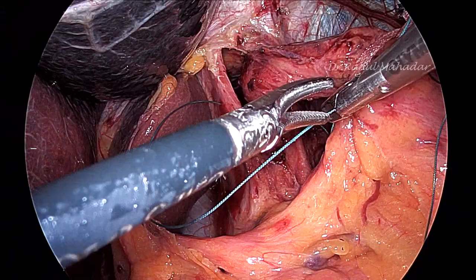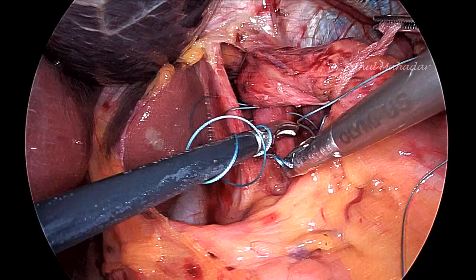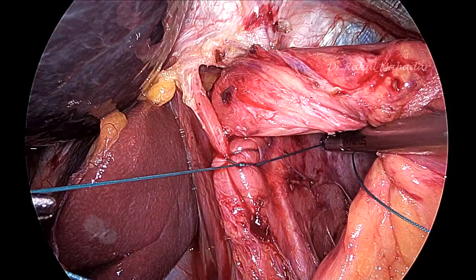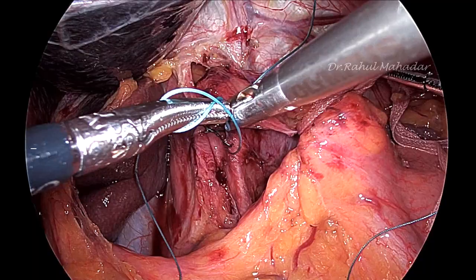I prefer to put 3 throws for the suture so that it will hold the suture at place. This I have learned from the legend of hiatal hernia surgery, Dr. Roy Patankar sir. From him I have learned this. So with 3 throws of sutures it can hold there, so there is no need of assistance.